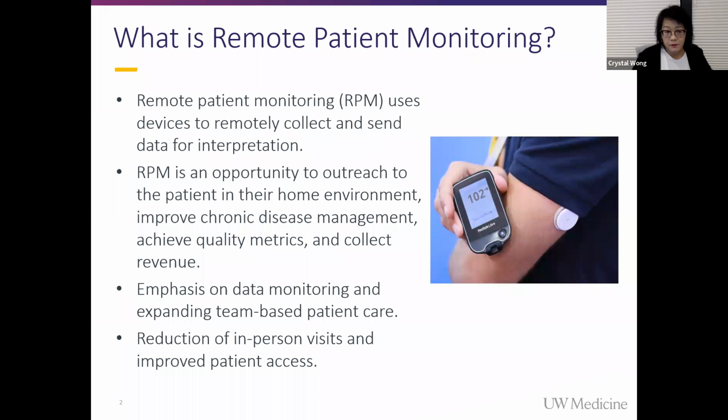So let's jump in. What is remote patient monitoring? I think most of you know the answer, but remote patient monitoring, otherwise known as RPM, uses devices to remotely collect and send data for interpretation. Most of us have already been doing this informally in less validated ways. A lot of my patients will send me crazy tracings from their Apple Watch, and I need to figure out what to do with it. This provides an actual clinical framework that's evidence-based, with very good outcomes data behind it, and will be one of our first formal forays into this in primary care.